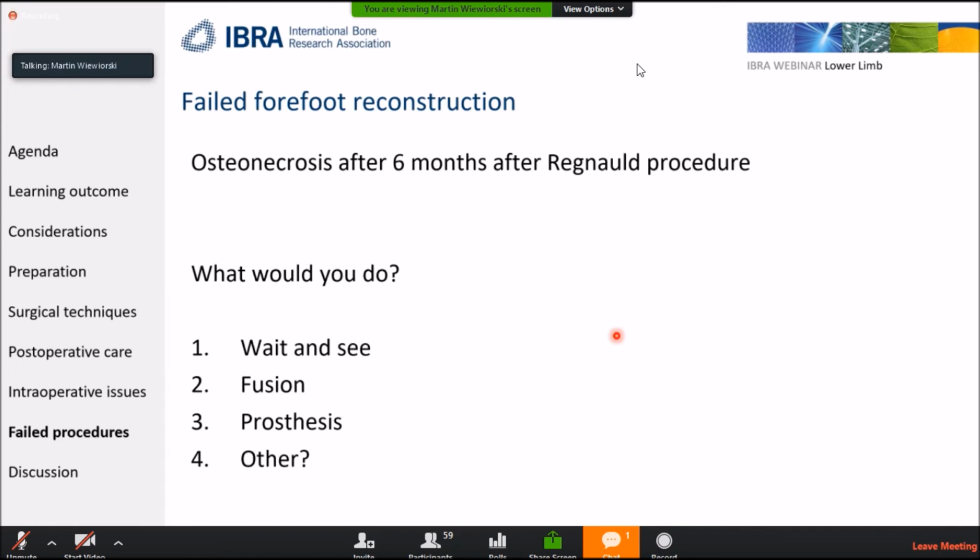She's active. I think this kind of implant works really well in the hand because there's basically no weight bearing. But you have to walk on the big toe. From a biomechanical point of view, it takes a lot of strain, and I don't think this implant will eventually help her. I'd rather not go for this kind of procedure, but this is definitely an option.